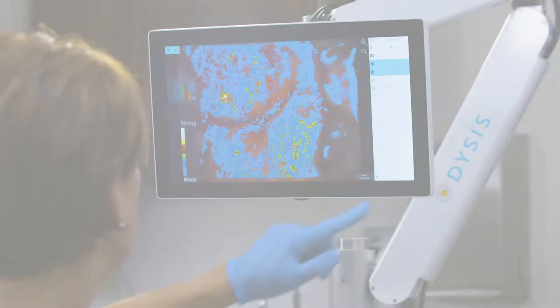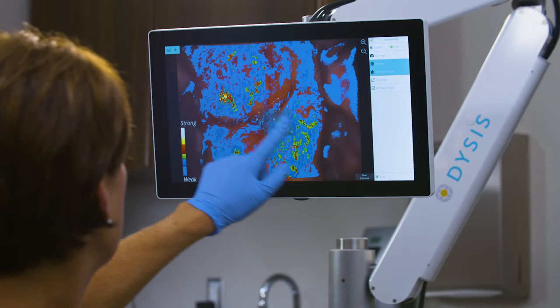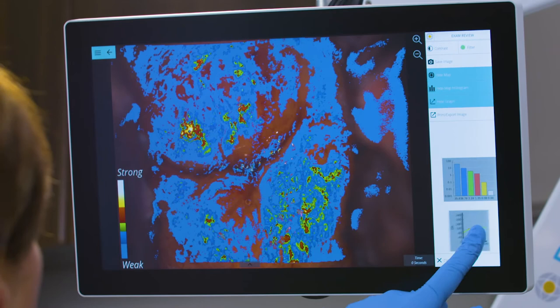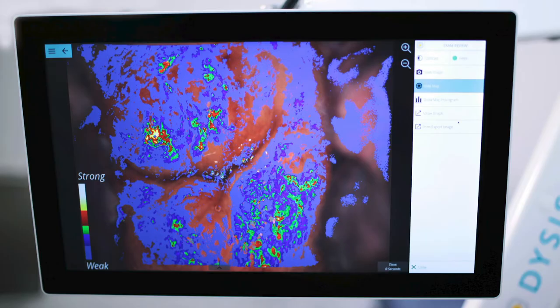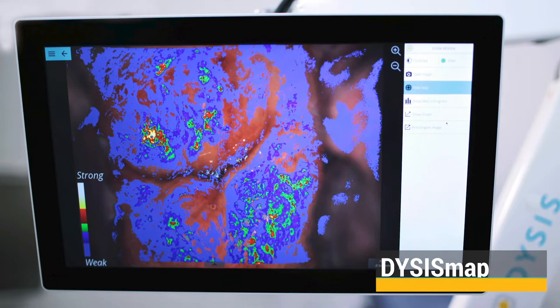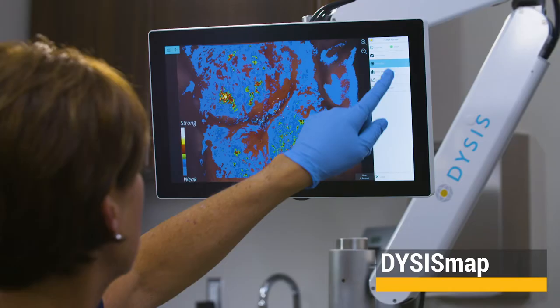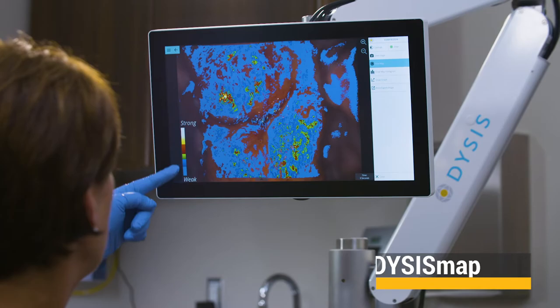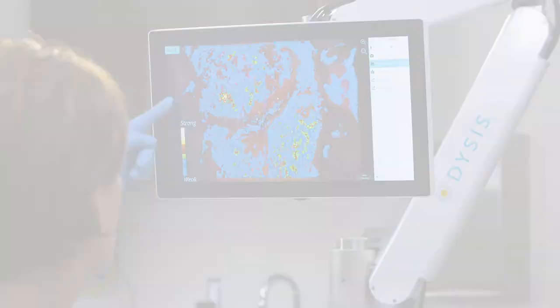In addition, DYSIS uses a proprietary technology to standardize the exam and quantify the intensity and duration of the acetowhitening effect to create a color-coded map. The DYSISmap highlights the most intense areas of acetowhitening to help the provider identify potential areas of concern to biopsy.